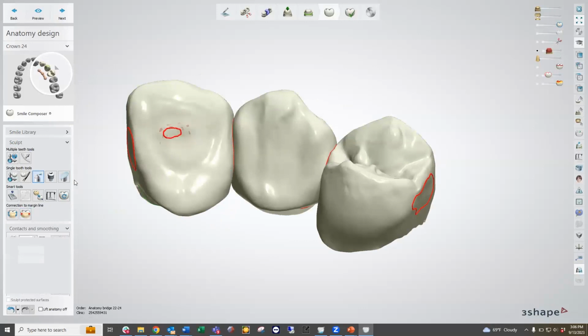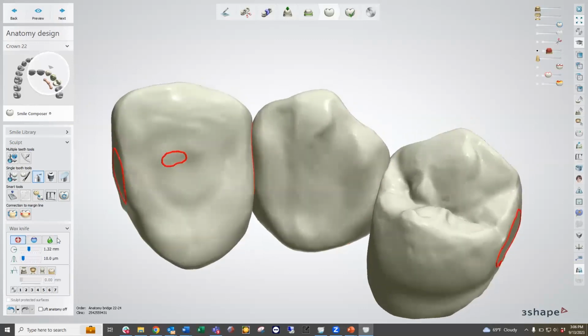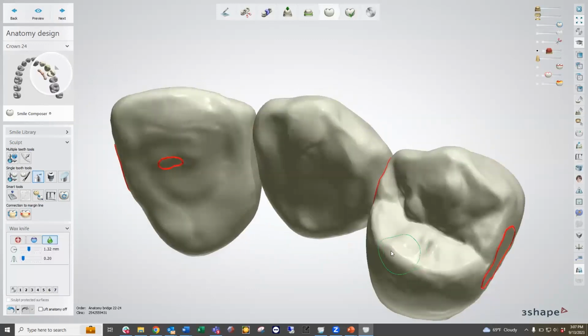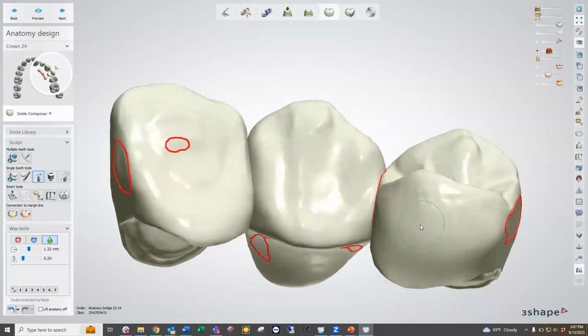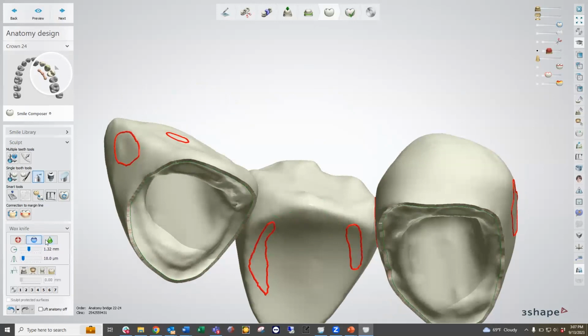So we know that we're always going to be at least minimally thick. I know that I may have a fight between finishing this unit versus going too thin with the material structure, but I always allow the material structure to meet the minimum thickness requirements. That way we're never going to be below the standard that we're looking for, that minimum thickness to meet the strength that we're looking for. And under here, again, I just don't like the unit touching the gingiva, so I'm just going to subtract a little bit over here, and we're good to go.